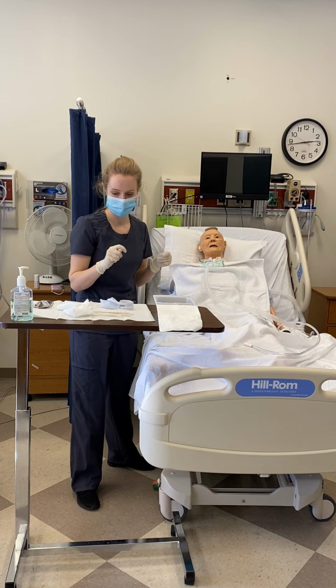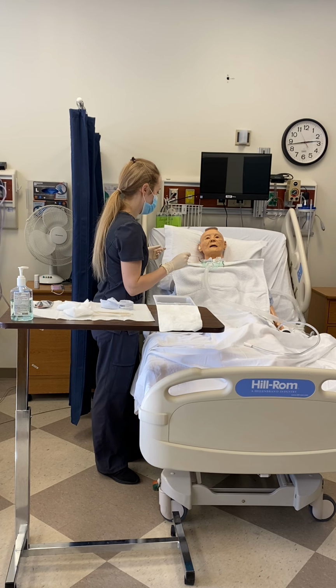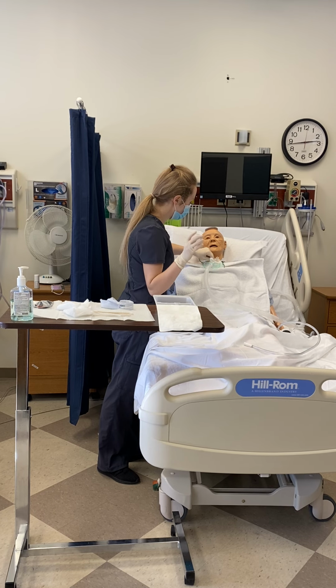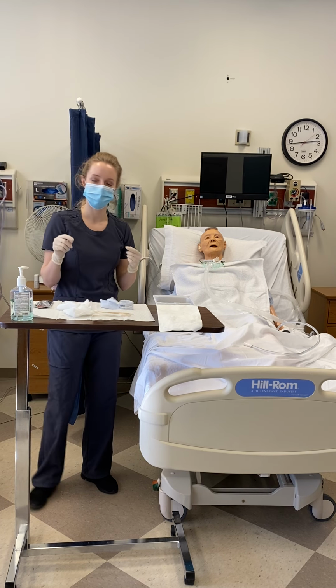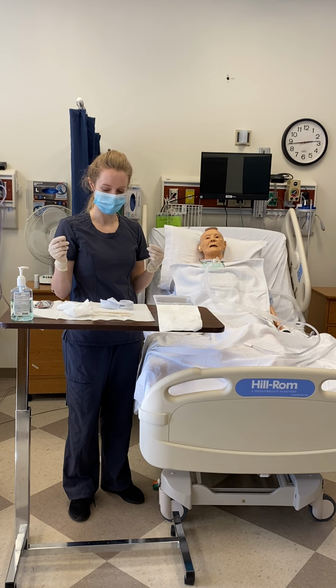My next step is to clean the area around the trach, and so I will remove the dressing, trying to stay as sterile as possible. So I am keeping this hand clean. I'm taking this dressing, I'm looking at it. Are there any secretions, crustiness, anything I should be documenting, anything to be concerned about?